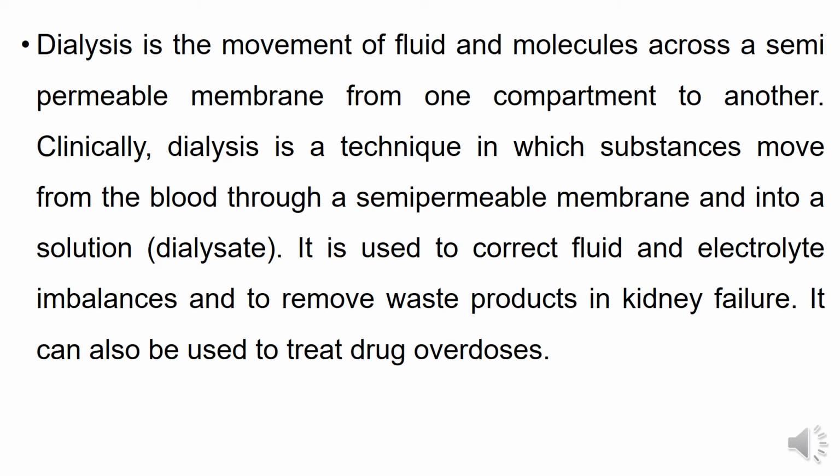Dialysis is mainly used to purify the blood. Here there is one semi-permeable membrane. By using this semi-permeable membrane, we clear the waste products.